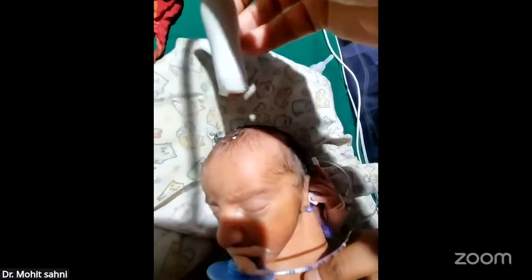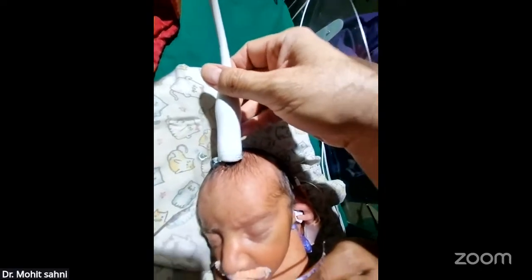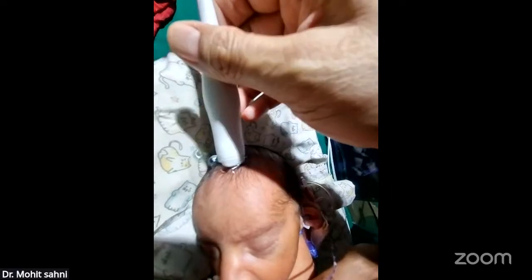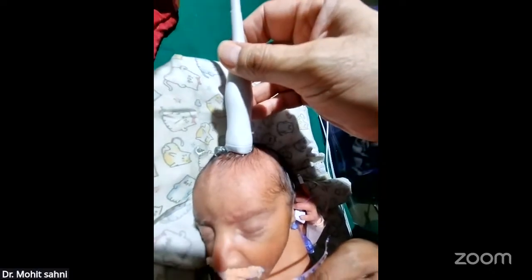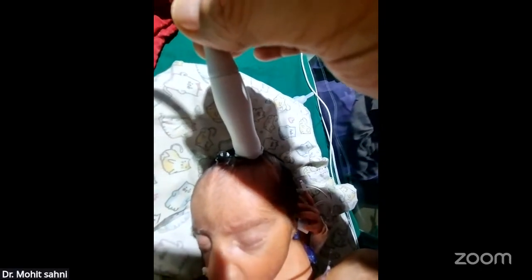And we always start from the most anterior section. From anterior, we sweep posteriorly. So C1 will be most anterior. Slightly go backwards, posterior is C2, C3, C4, C5, and C6 is the most posterior, like this.